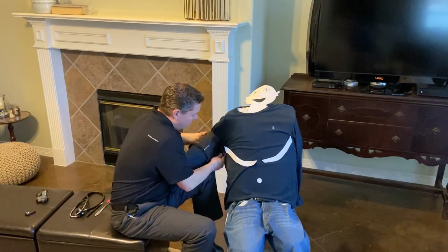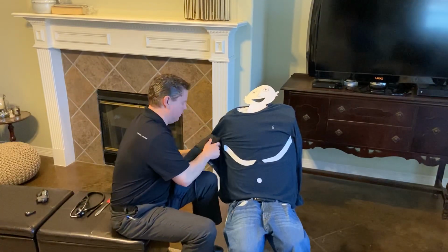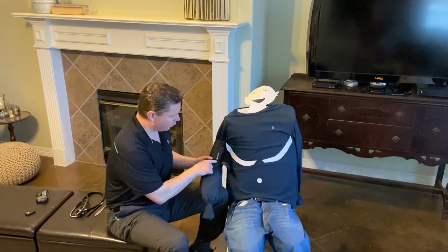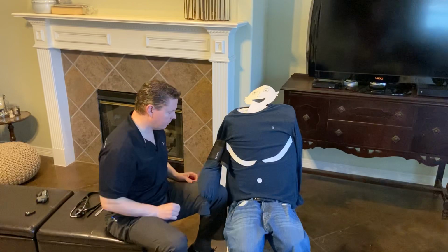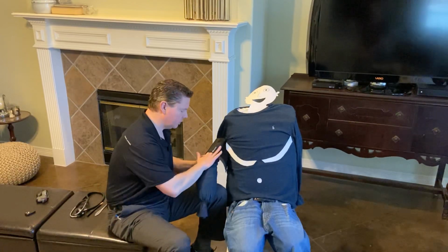We'll apply the blood pressure cuff. Again, should be over the brachial artery. See the crease of the antecubital fossa to the bottom of the cuff is approximately 1 inch, 2 fingers snugly underneath.